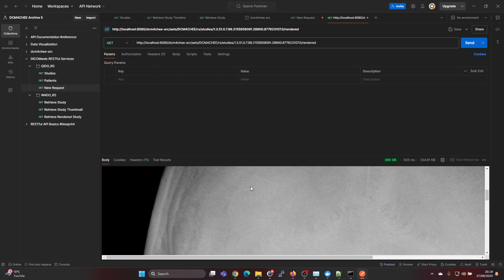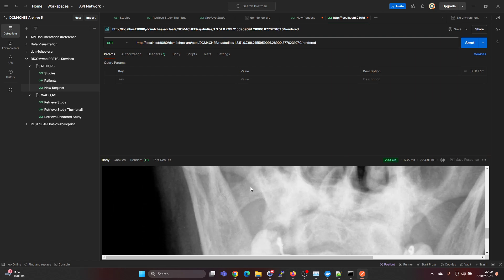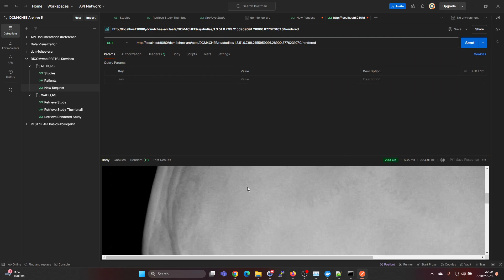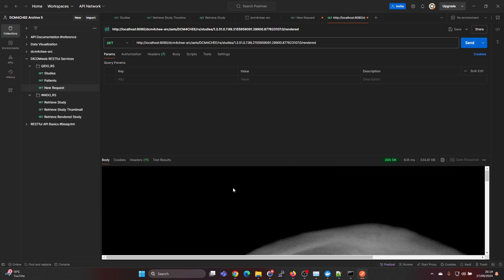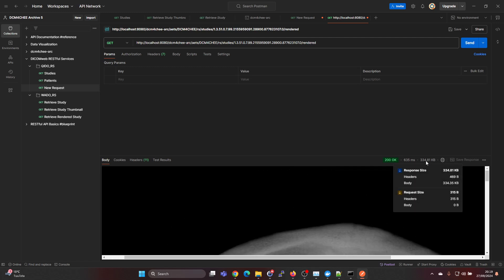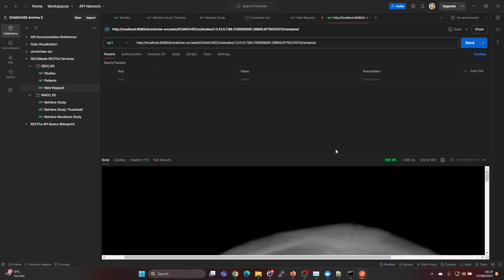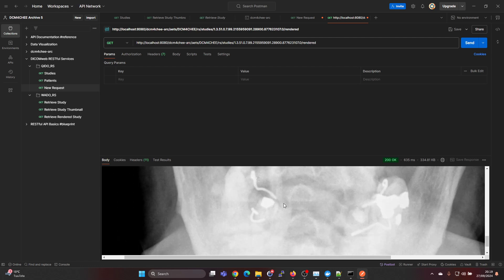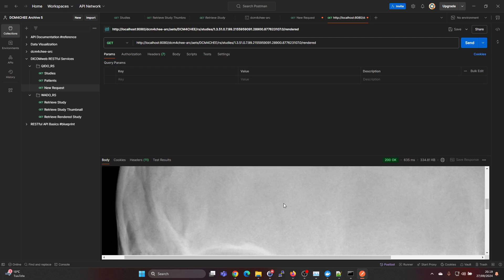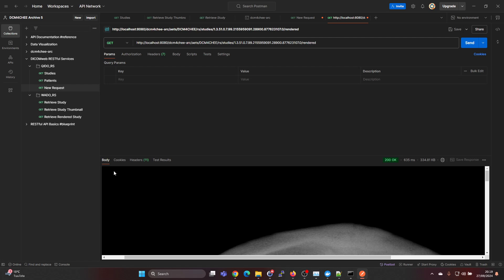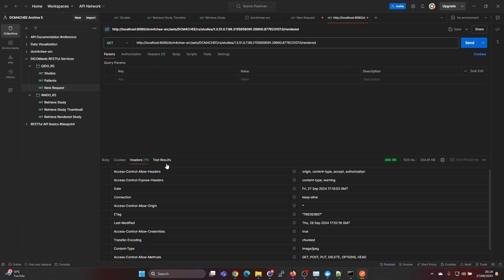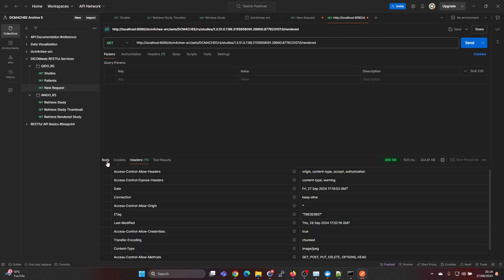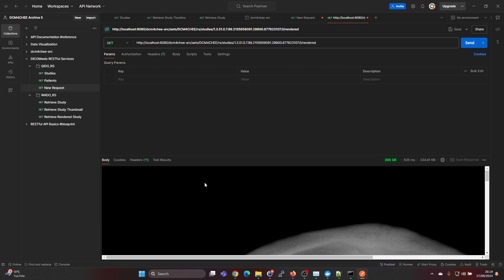Now we're actually getting the study in JPEG format and it's 334 kilobytes. It's actually rendering it in the DICOM archive on the backend side and then we get this result here.